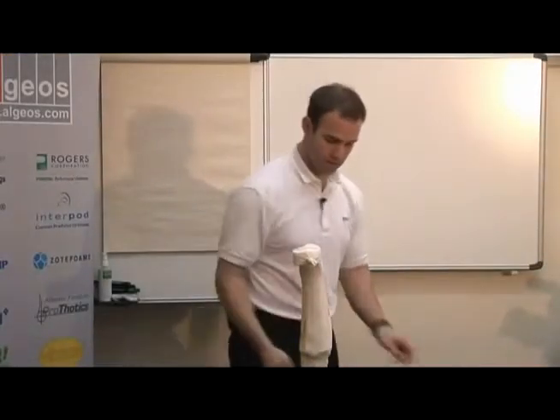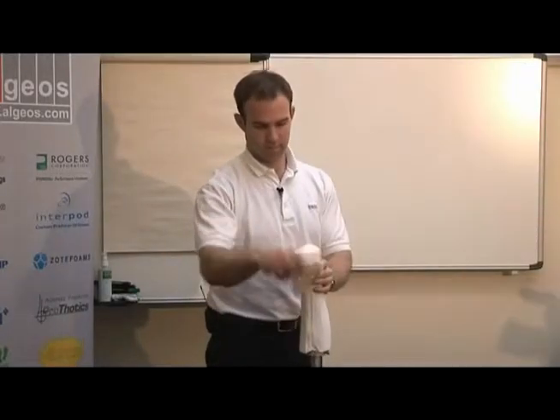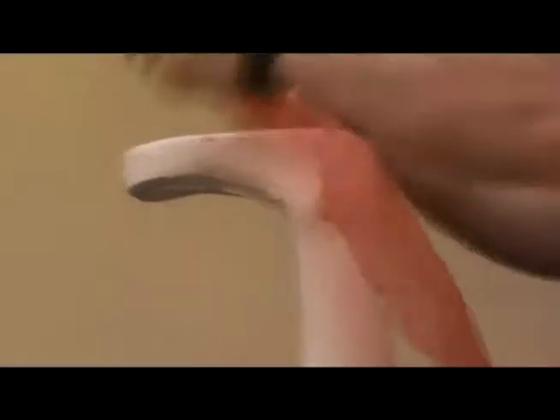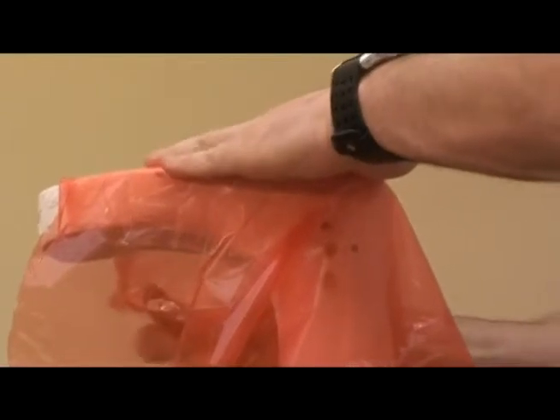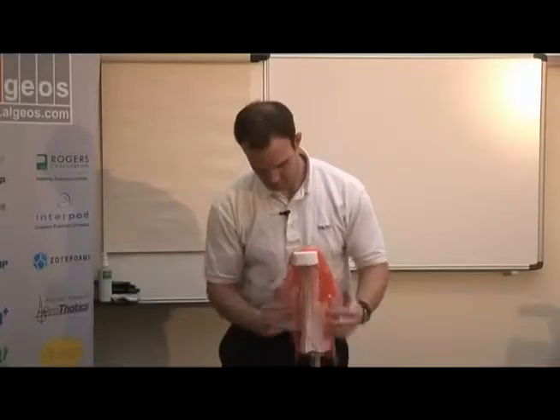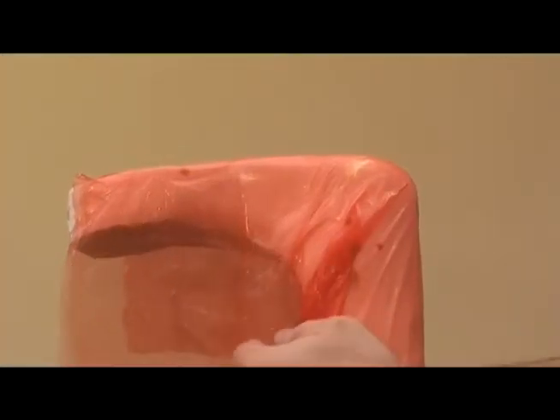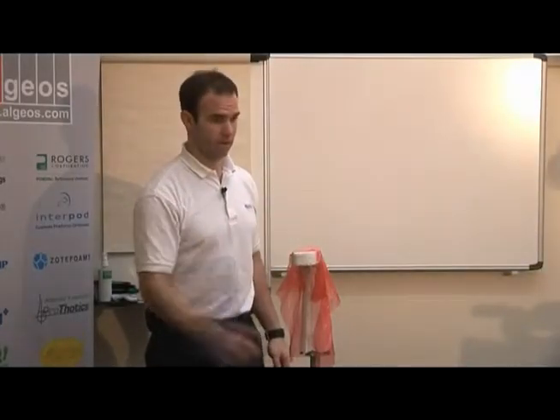If I want to get it nicely stretched on, I can take off my cotton stockinette. The main thing is that it's a barrier between the plaster and the carbon.